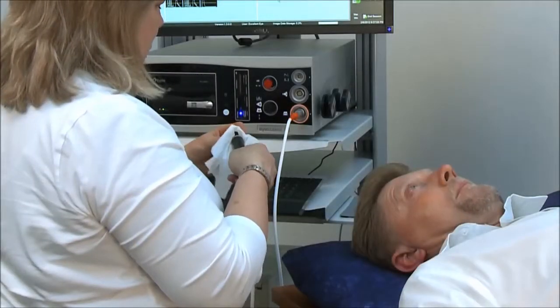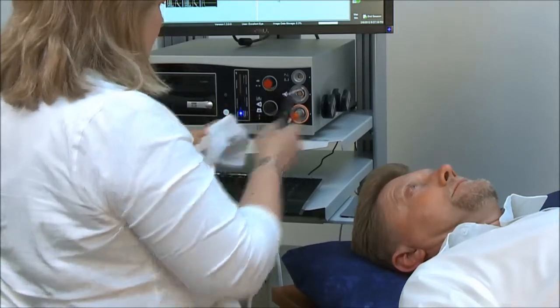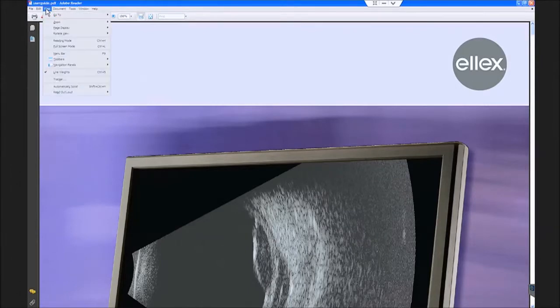As soon as patient examination is complete, clean the probe and place it upright in the probe holder. For further information, please refer to the iCubed instruction manual available under the Help tab on the iCubed system, or visit the Ellex website.